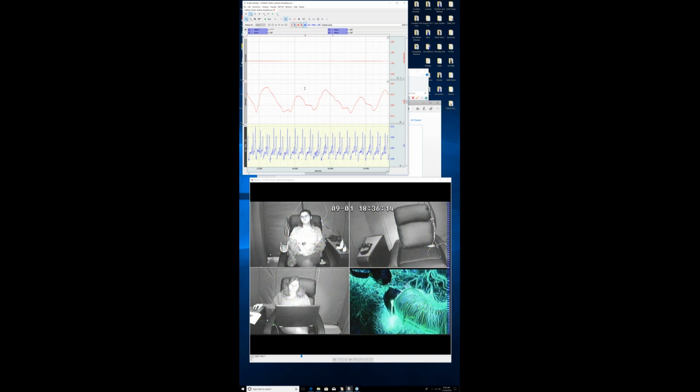Okay. All right, I've unmuted myself so that you can hear me more clearly. Another question is, is it possible to synchronize EEG data in mice with video? Oh, hang on, let me unmute you. Okay, perfect.